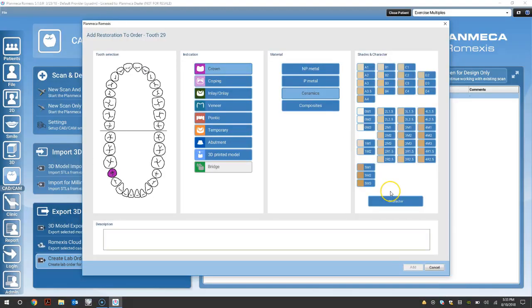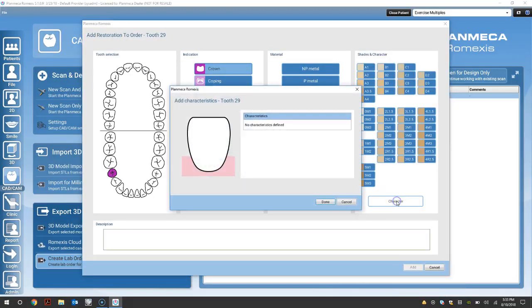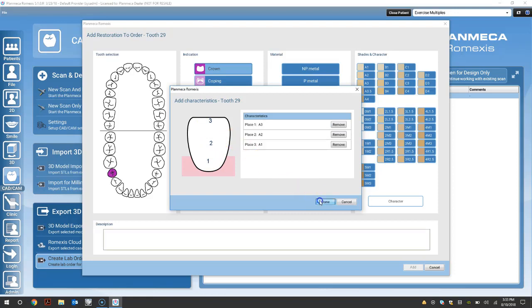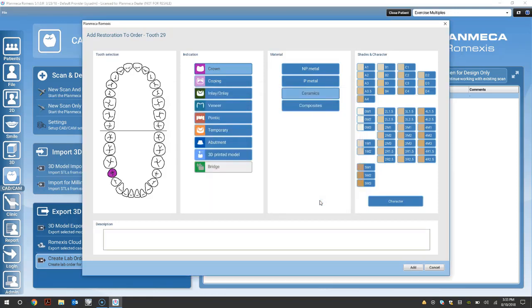To add characterization, click character. Select the first area. Enter the shade. Select the second area. And select your shade. And continue to add points of reference for your characterization.